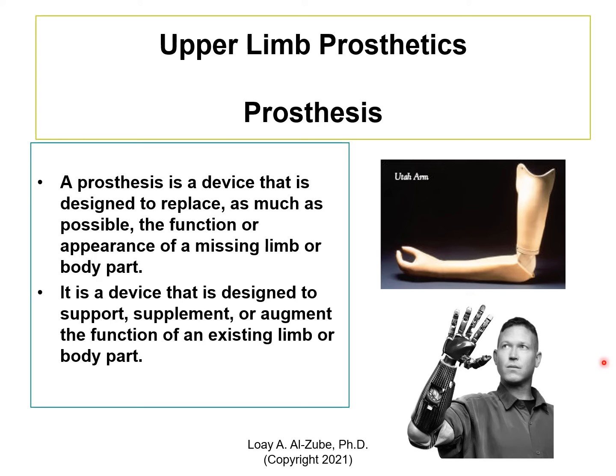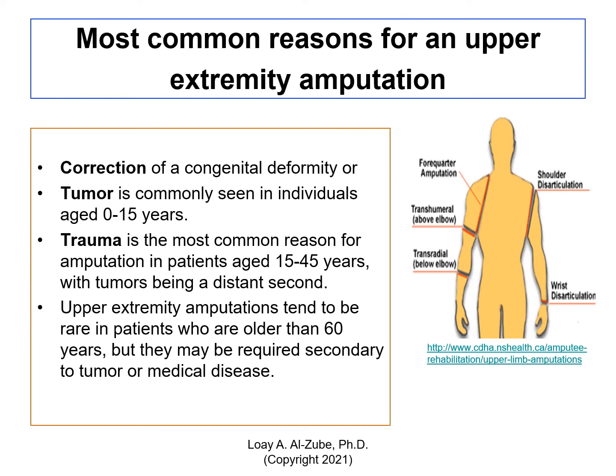So that's all general, but I don't want to work on the plastics, traditional prosthesis. We would like to do something like this, an active myoelectric prosthesis. That's what we're going to call it, myoelectric, because it's using the electrical activity to activate a robotic arm. And this is also called externally powered because it has batteries that power it. But before we go there, we need to talk about the tissue itself.